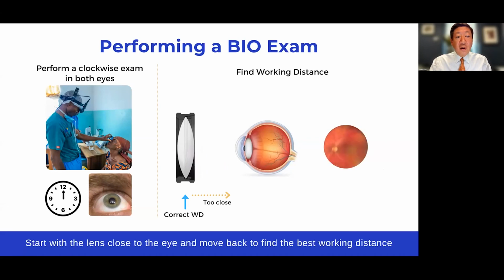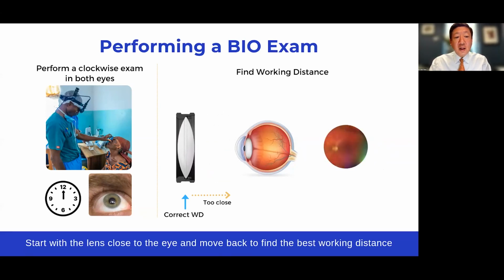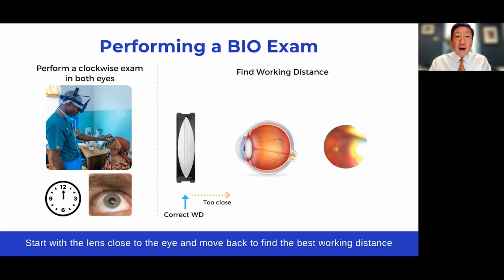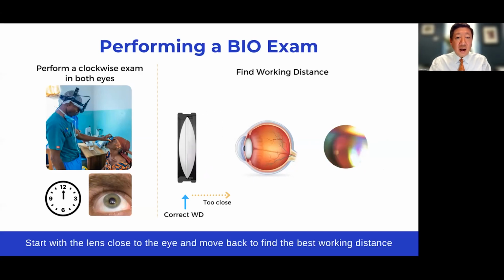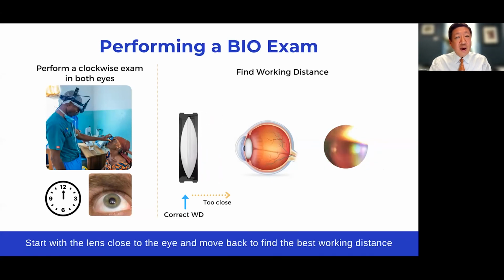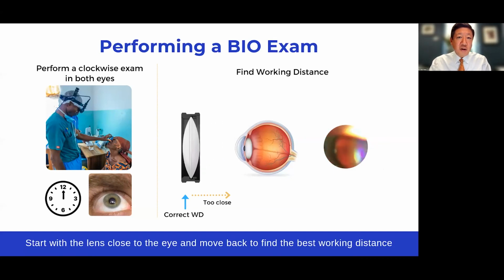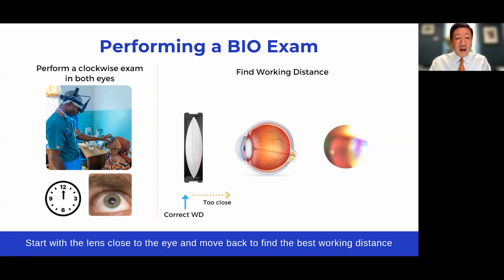So if you have the patient look up at the 12 o'clock position, we'll know it's there. If at 2 o'clock, you'd say at 2 o'clock in the right eye, we can precisely describe the pathology. For instance, lattice degeneration from 1 to 2 o'clock, 1/2 disc diameter posterior to the ora serrata, with atrophic holes and without subretinal fluid. It's a precise description of exactly what we look at. And we can describe that as we go all the way around the eye.